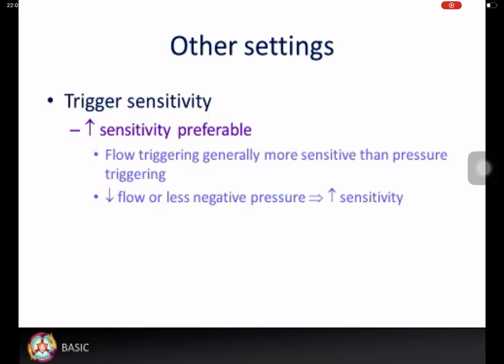Triggering may be flow triggered or pressure triggered. Flow triggering is generally more sensitive. The smaller the flow or the smaller the negative pressure, the more sensitive the trigger.